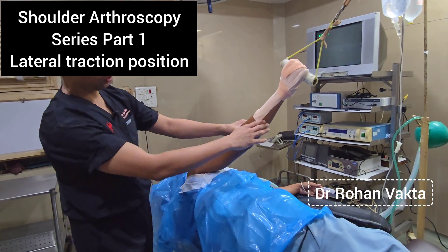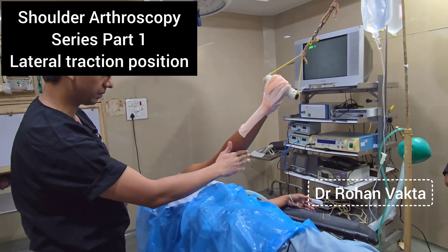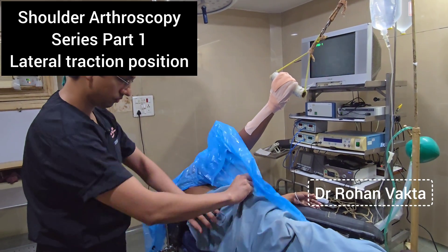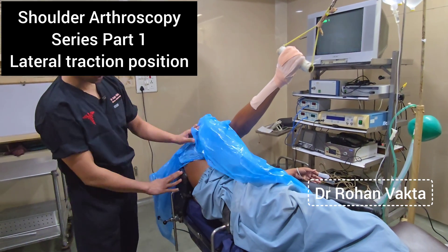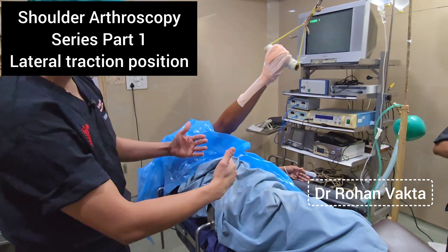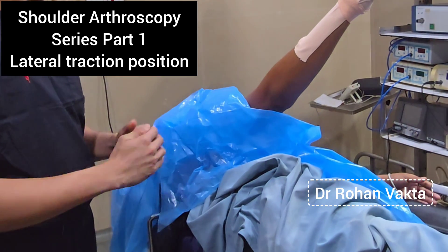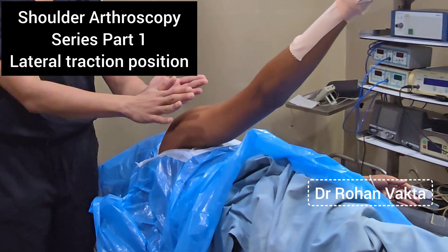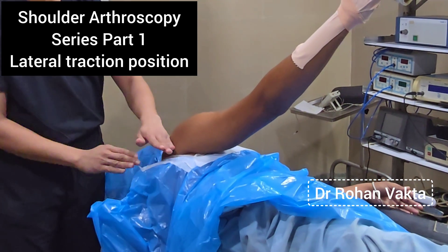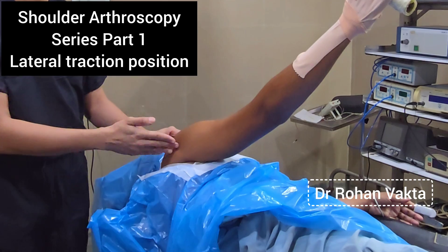The angle is around 45 degrees. This case is a bankart repair where we give around 45 degrees of abduction. We have given back support at the level of the buttocks and at the level of the scapula, and the body is kept around 30 degrees posteriorly tilted. Because the scapula is 30 degrees anteverted, we keep the glenohumeral joint parallel to the floor so that our sheath and trocar can easily enter into the joint.